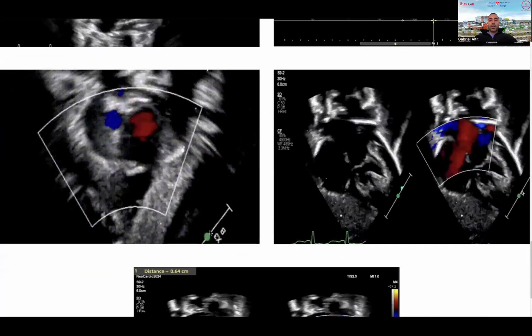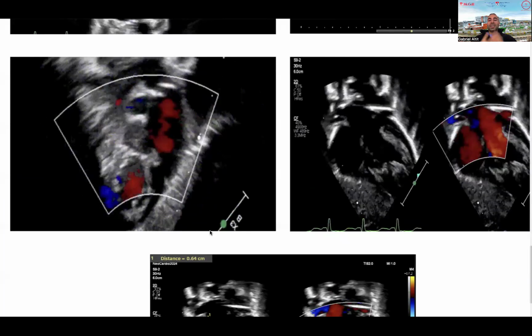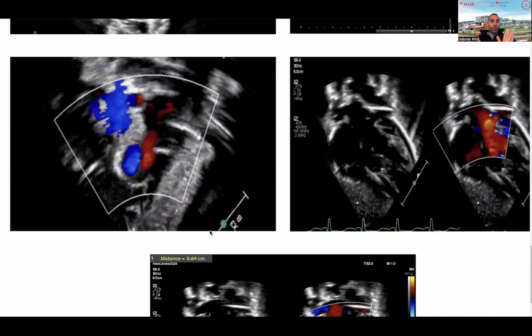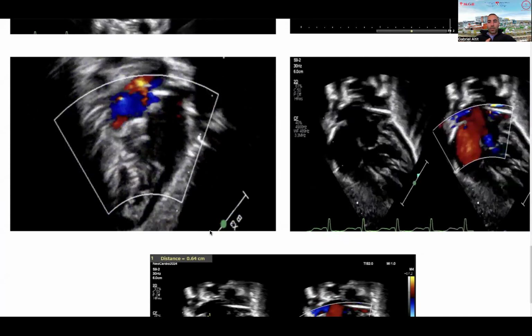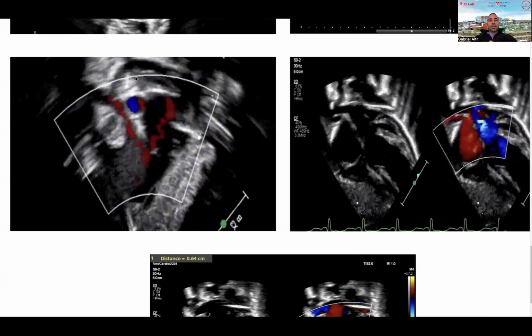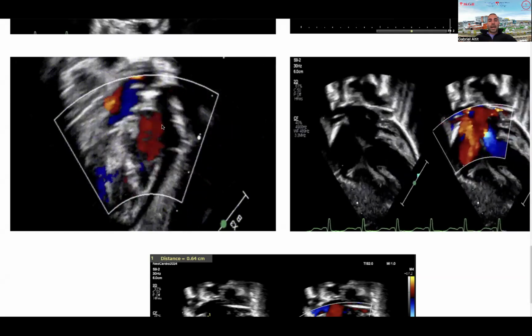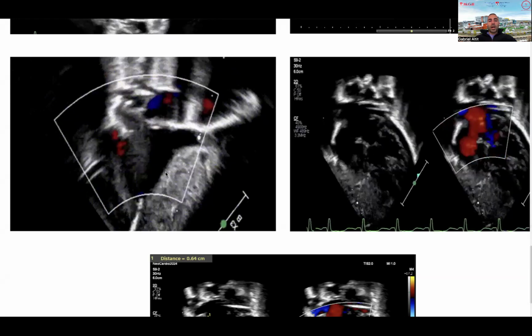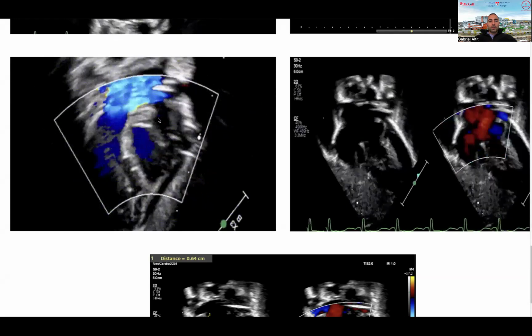And then finally, a quick overview of the subcostal view. Obviously, I've selected some of the clips that we acquire in our TNE. There's much more than that, but for the purpose of this particular case, this is what I wanted to provide in terms of a snapshot. So this is a view of the subcostal. You see the liver, and this is what we call the short axis in subcostal because you get to see a bit of the short axis of the left ventricle as we sweep. So I'll show it. It's here.